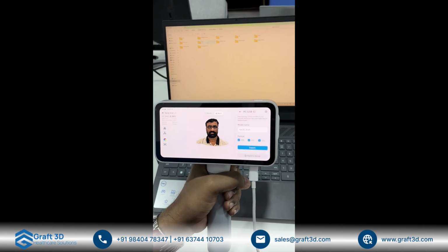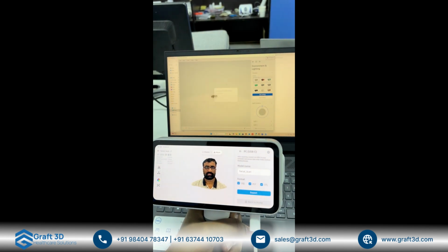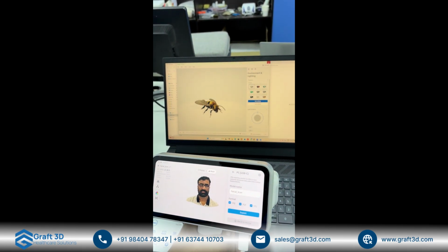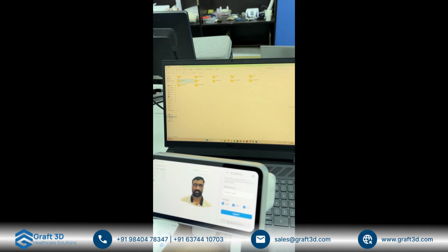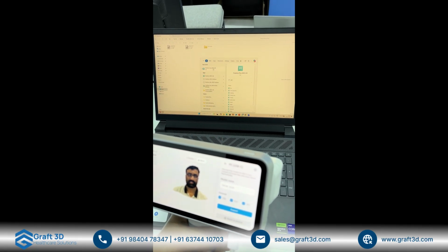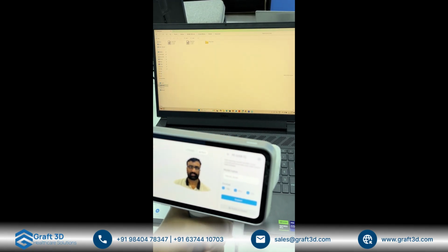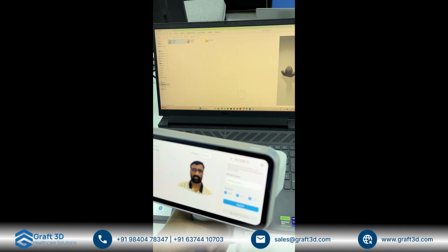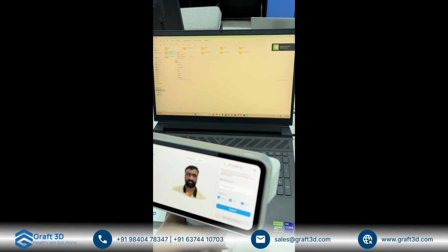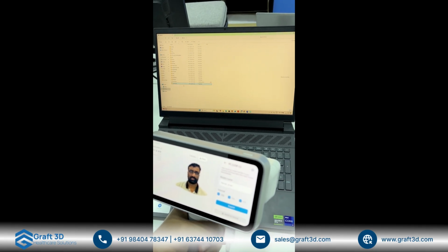Show the screen, my laptop screen. You should scan. Right click, copy, then paste it.